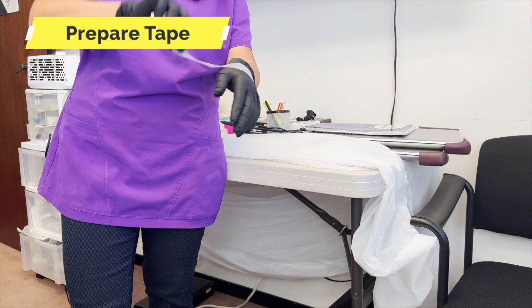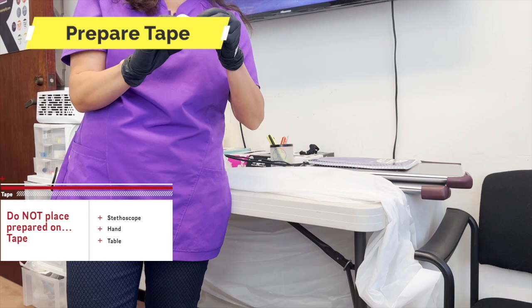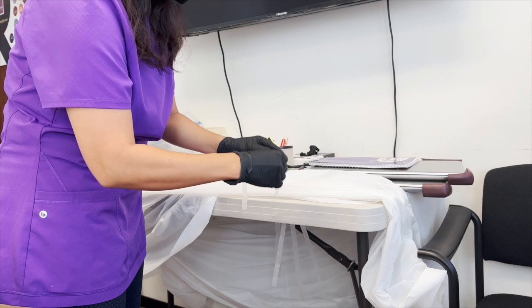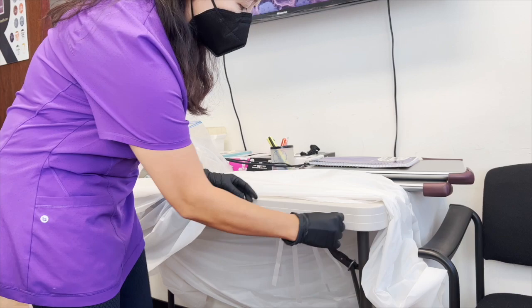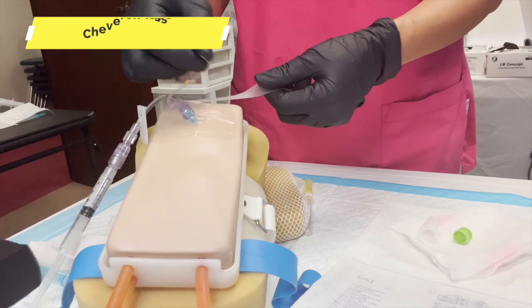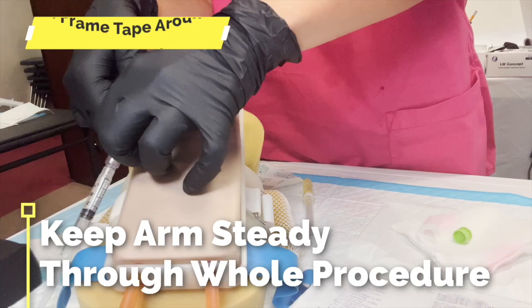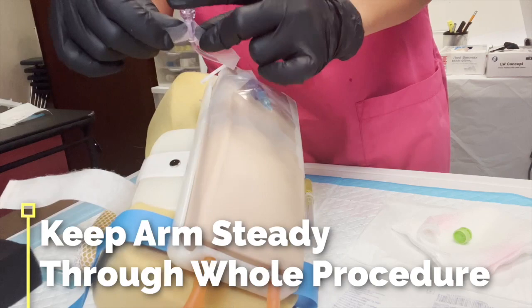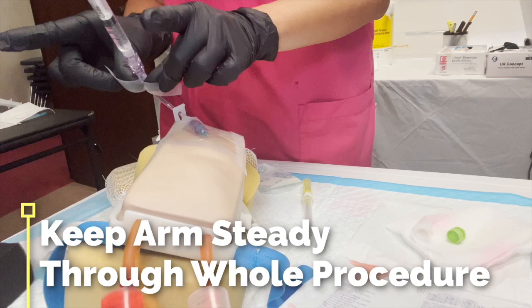For tape, do not put it on your gloves — put it on your clothes so it's easier to access. Prepare tape by making about six skinny strips. Nothing touches except the base of the tape. I did the tegaderm — ready. What's the next step? Chevron the U with the sticky side up. Crisscross it for the chevron, then frame it around. Make sure the U is nice and wide right here — not a sharp U. I usually put one more strip.